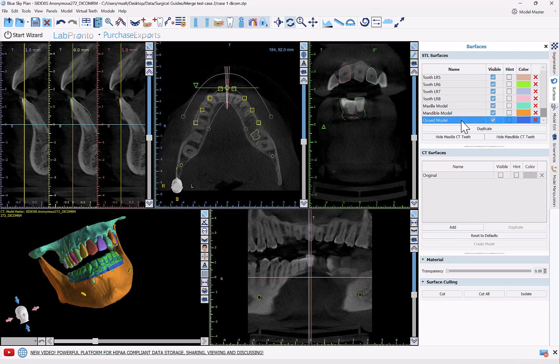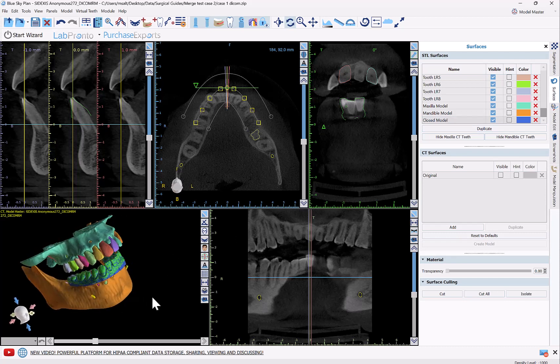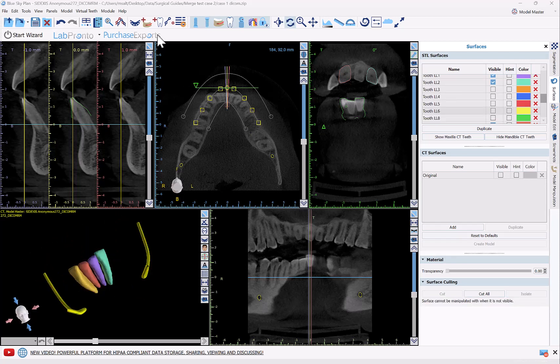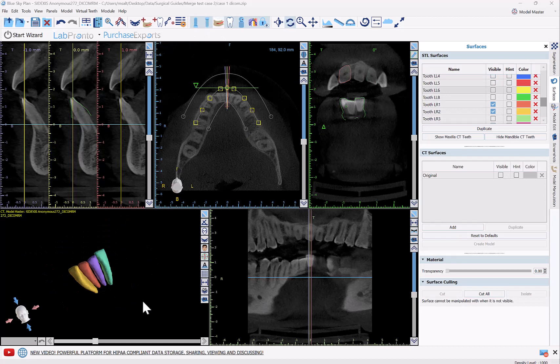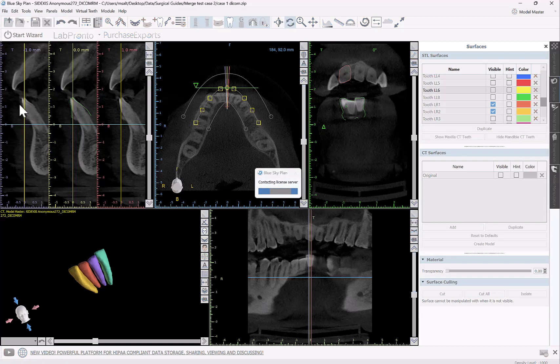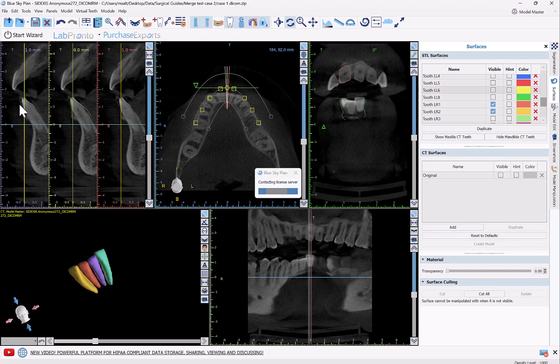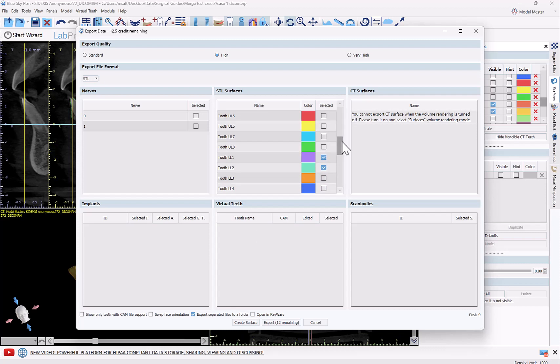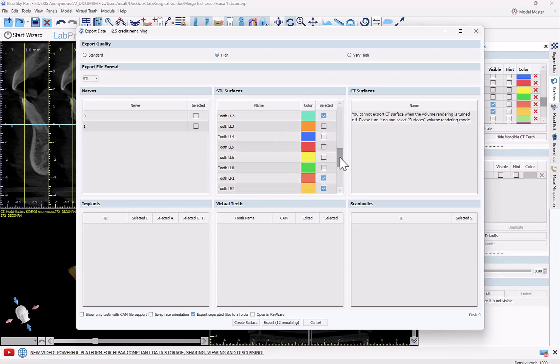Now I could really do this tooth by tooth, but if I have multiple teeth I want to subtract from the model at the same time, there's a quicker way of doing this. For example, if I want to extract our lower anterior teeth, what I could do is simply go to File > Export Data — and don't worry, we're not actually exporting the data, and at this point it would still be free of charge. What we're going to do is confirm that we have the correct surfaces selected, and then click 'Create Surface.'